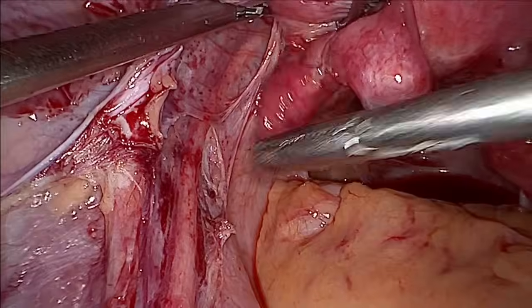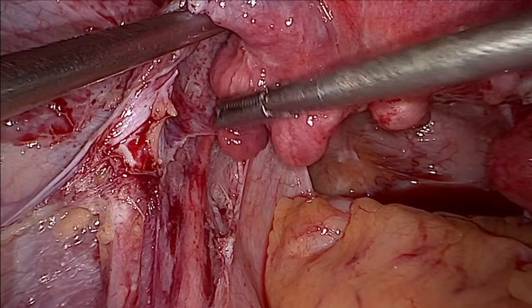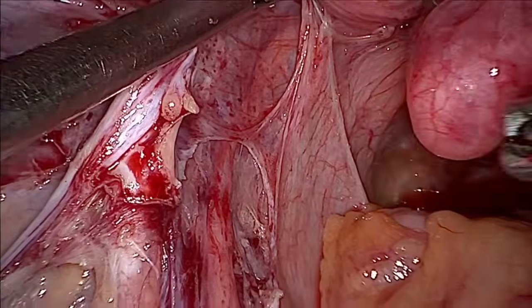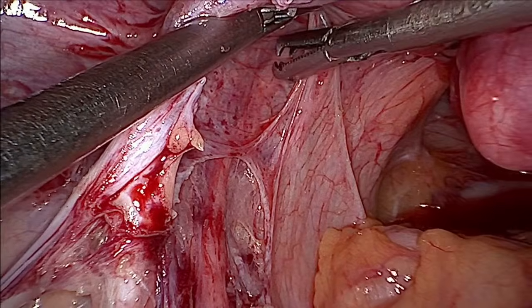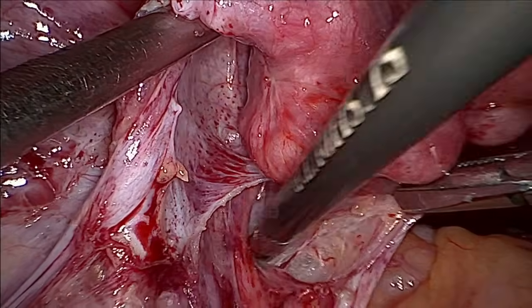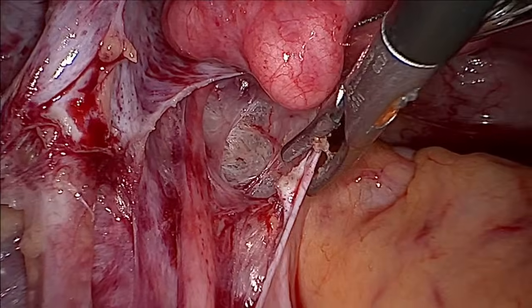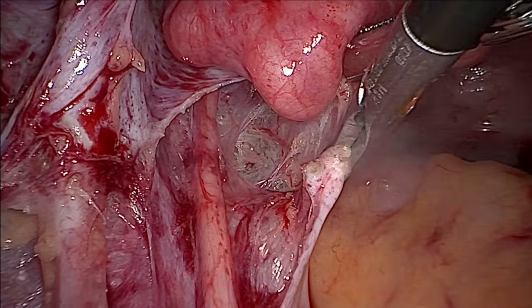Yes, very good. Okay, now it is clearly visible that the ureter is quite lateral. Okay, the ureter is going there. We don't need to go further. We'll just pull the peritoneum, the broad ligament which is on the medial side here, and we'll just start to open this up.